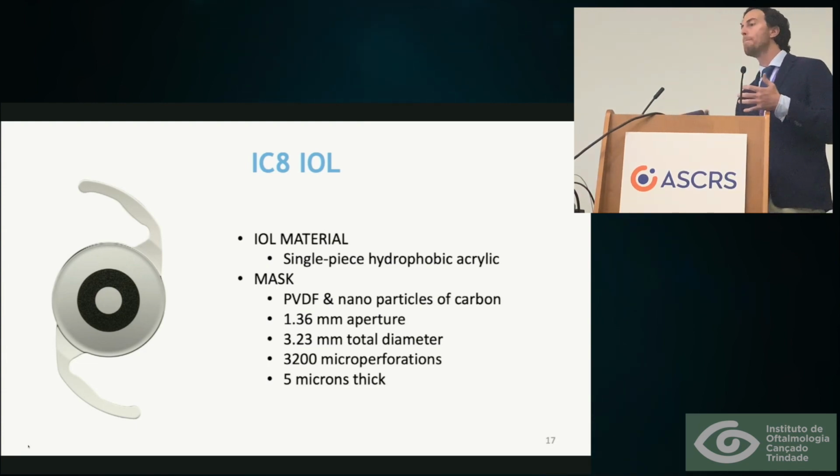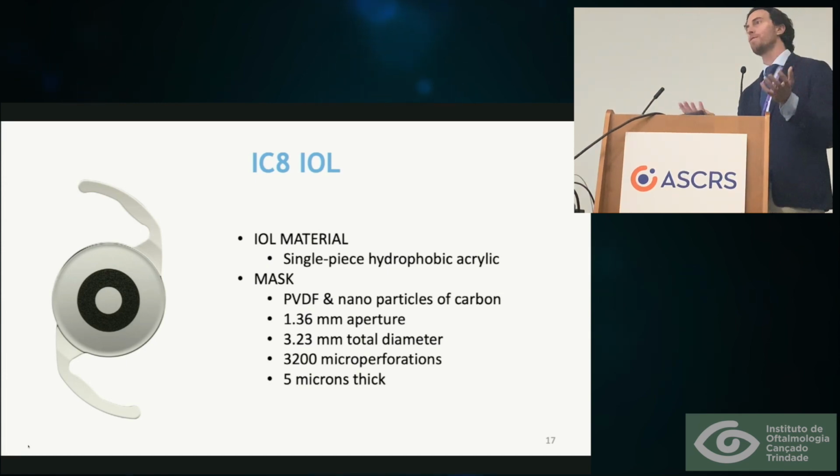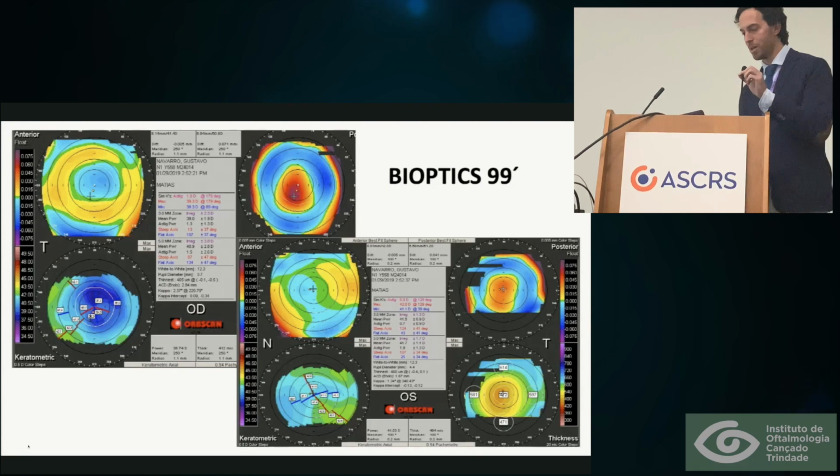And the IC8 might work better for presbyopia because you have more light passing through the periphery, and it's a little bit different in that behavior. And that's what I wanted to share. Of course, I'm going to share some cases with the extra focus that I love too.